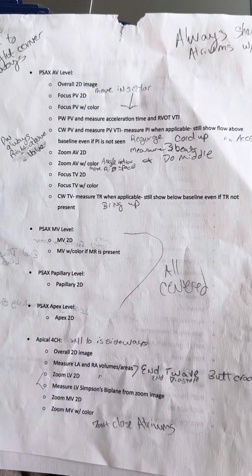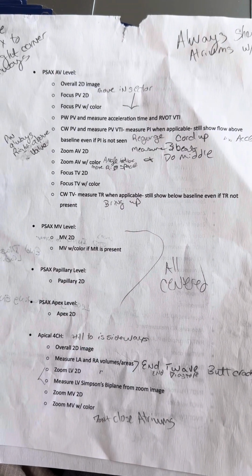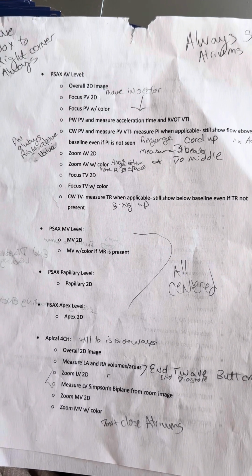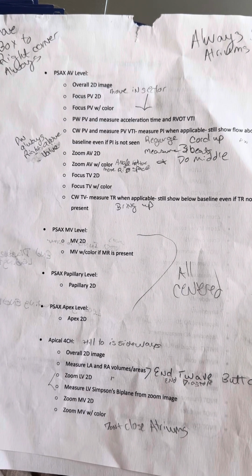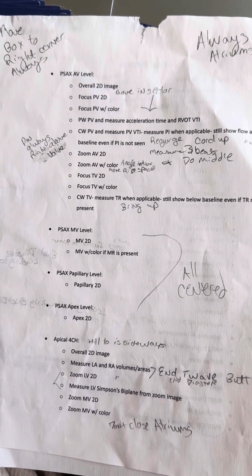Next, we go back to your AV in the middle. You're going to zoom it, then zoom AV and put color on it.